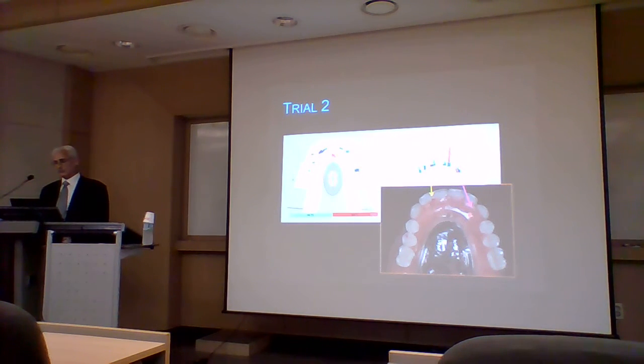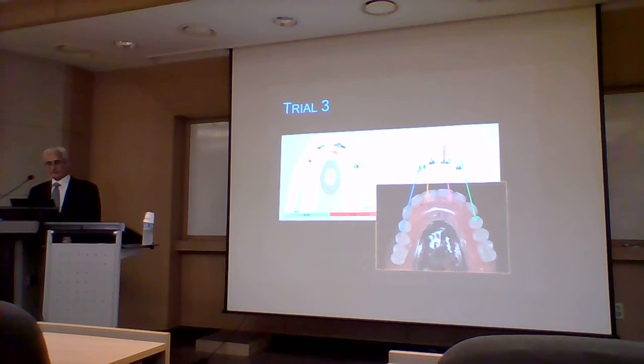You can see this is a very small mark. This is a moderately sized mark. 사이즈와 상관없이 포스가 높게 나타나고. So we would adjust only those 2 contacts. 그리고 제가 하고. And then again make a new recording.